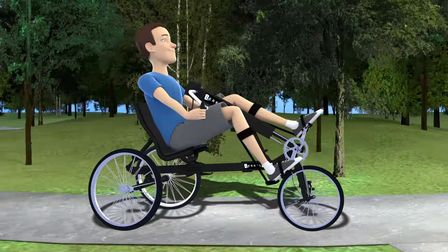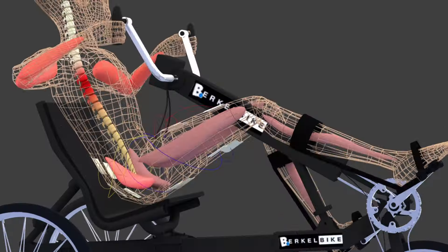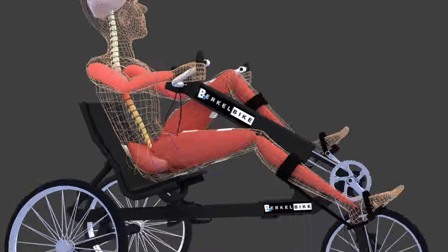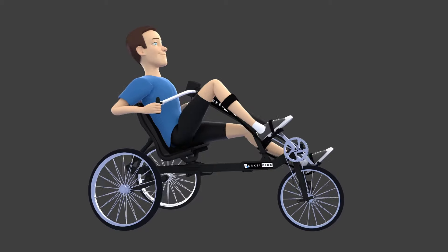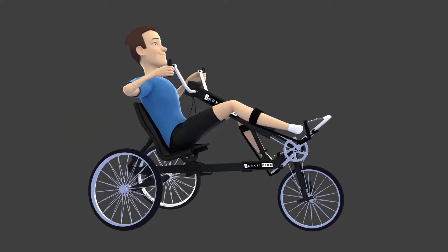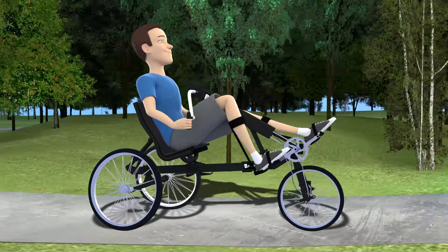These electrical impulses give orders to the nerves below Paul's injury. The nerves then activate his muscles in the same way as if the signals were coming from his own brain. Paul can now make active use of his own muscular strength and cycle with his own power, despite his complete spinal cord injury.